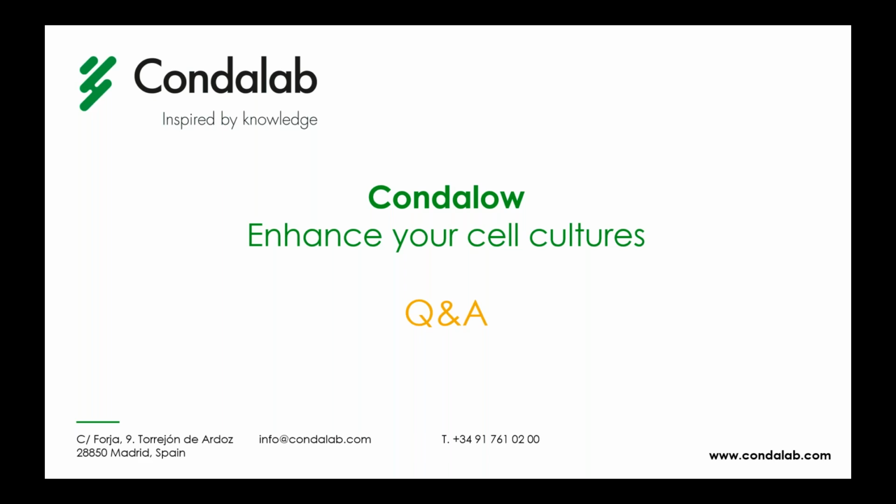And another question: what is the optimal concentration for Condalow? We usually work between 1 and 5 grams per liter, and using higher concentrations usually has negative effects. So the best concentrations are between 1 and 5 grams.